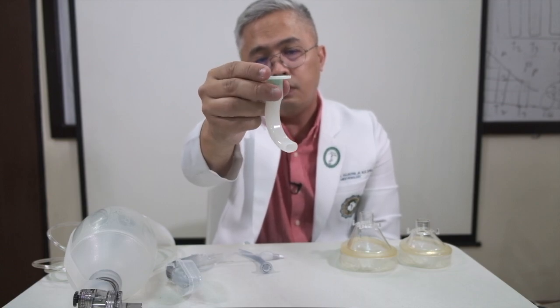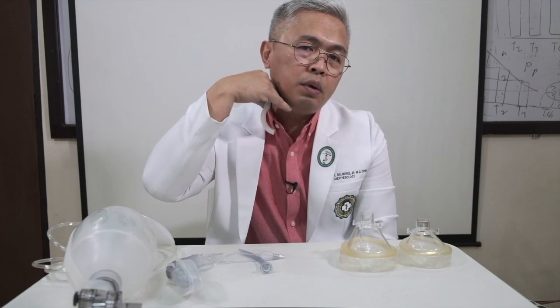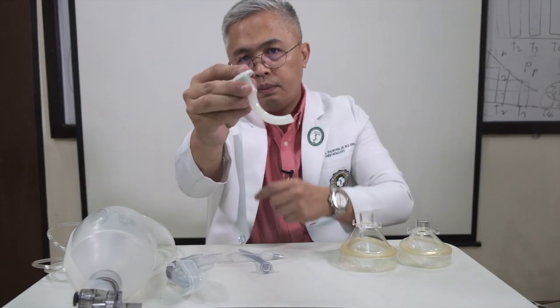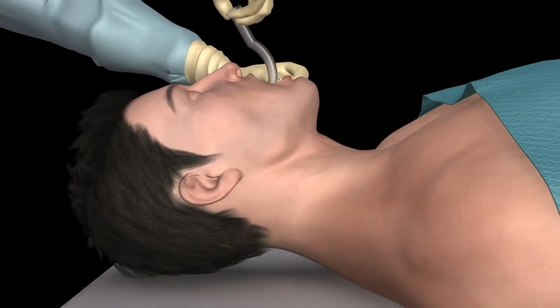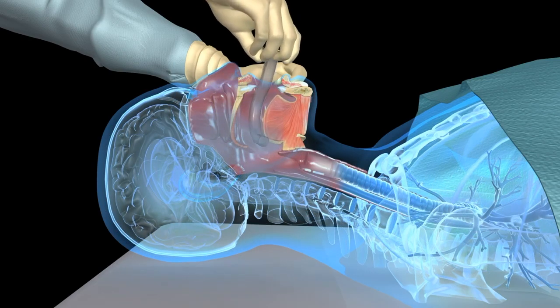By the name itself, it goes through the patient's mouth to the back of the pharyngeal area. It's supposed to lift the tongue up, and oxygen can go through here to the patient's lungs. This one is the oral airway, or the oropharyngeal airway.